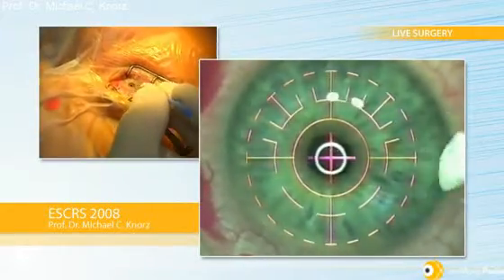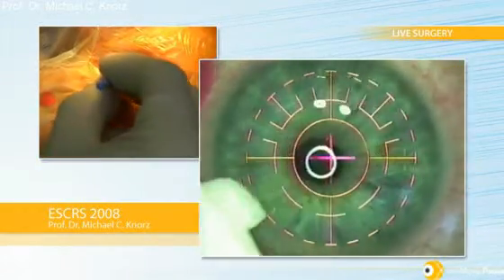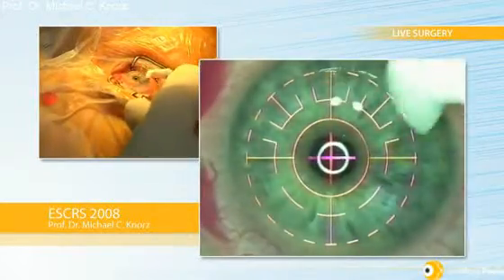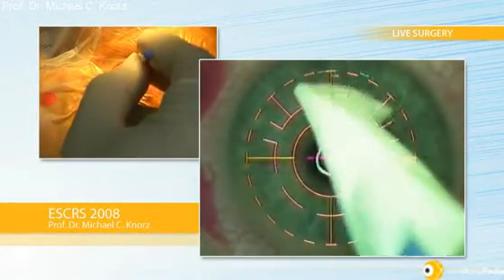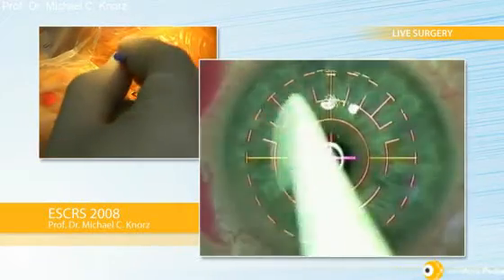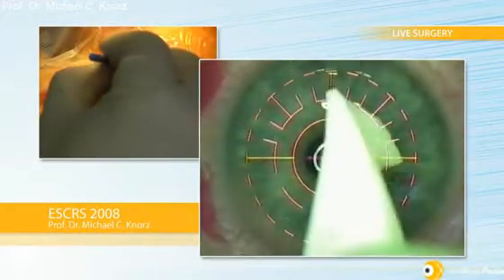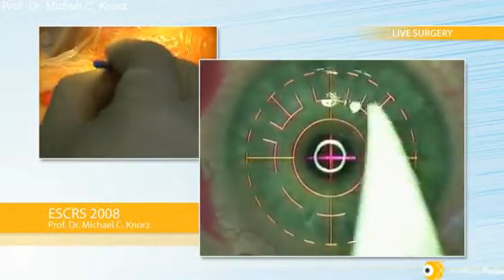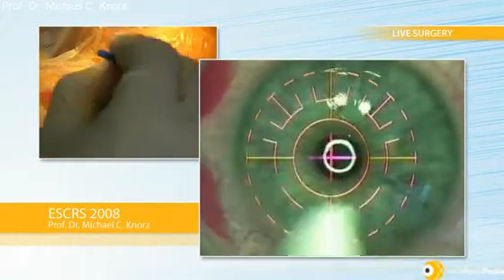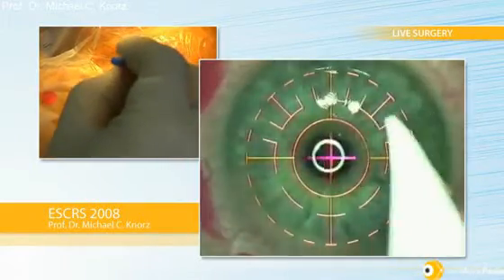I smooth the flap back into place and just carefully dry the edge. As you can appreciate, this is a 150 degree side cut — we have a beautiful edge. Basically the flap fits under the anterior lamella of the cornea, which gives us an excellent fit and a very nice, very strong healing, because there's more contact area between the peripheral stromal lamella and the edge of the flap. I did an animal study showing healing is about twice as strong with the inverted side cut compared to the standard 70 degree side cut. So my preferred side cut right now is definitely the 150 degree side cut with the new IFS laser.